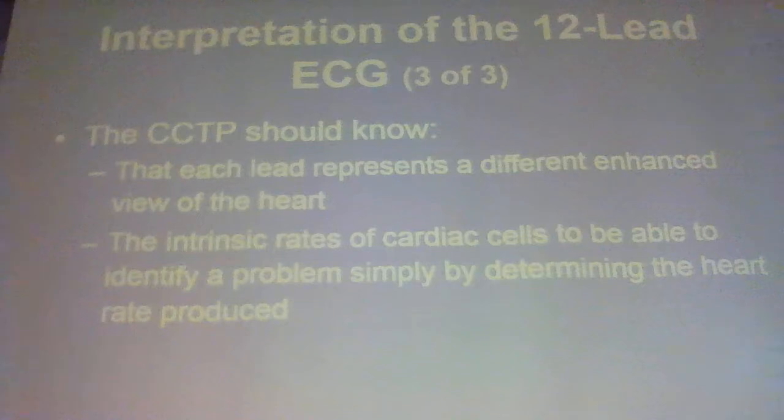All right. So just remember that a 12 lead specifically looks at the left ventricle. If I want to know anything about the right ventricle or the back of the ventricle, I have to go around there and look at it. It's just like pulling up on the A side of a house. You want to know what's going on in the CD corner, you have to go around there and look at it. That's why you do a 360. It's the same thing. Okay?